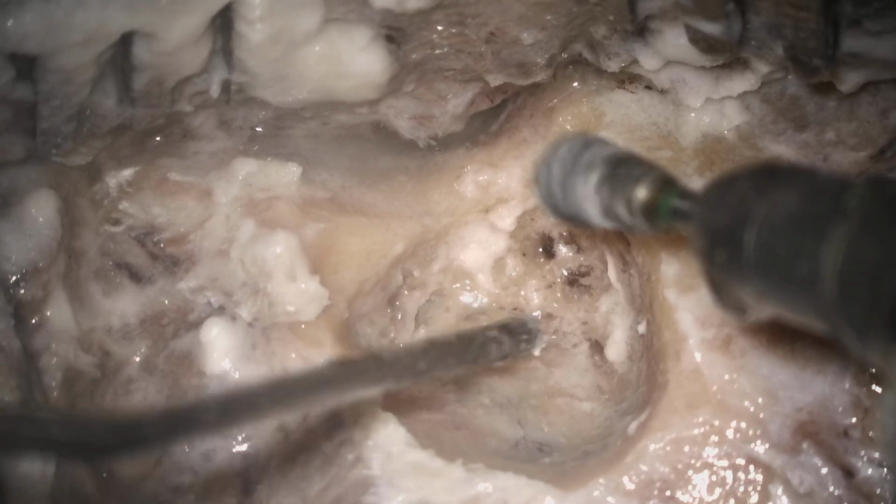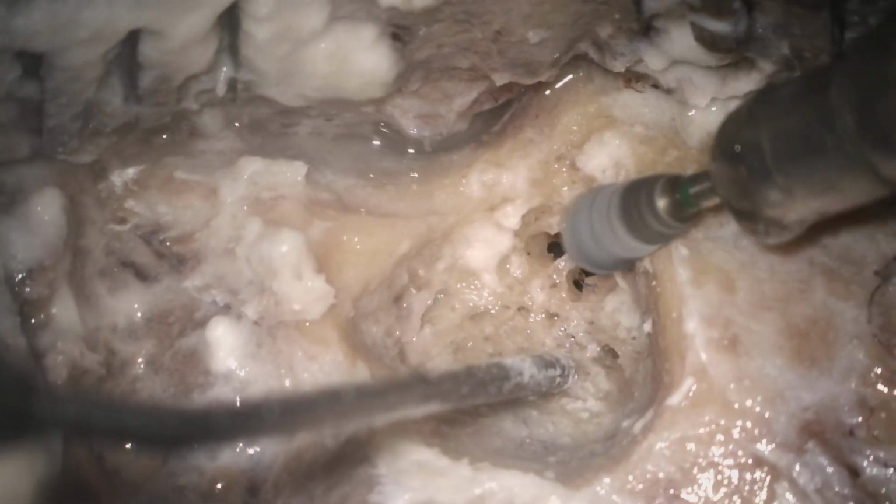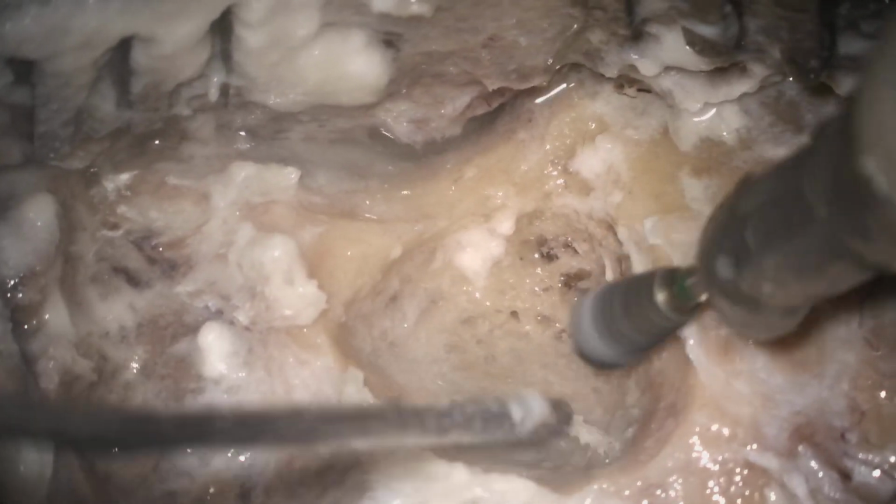So this is the sigmoid plate. So this will be the mastoid anteromedially, and here we will delineate the middle cranial fossa or the tegmen plate. So look at the direction of the bur. Always use your bur in the correct direction, so that will minimize the trauma.